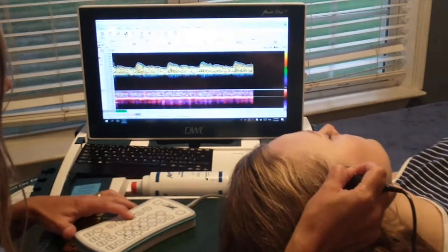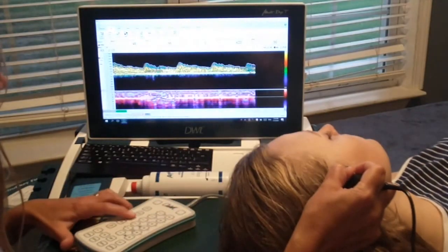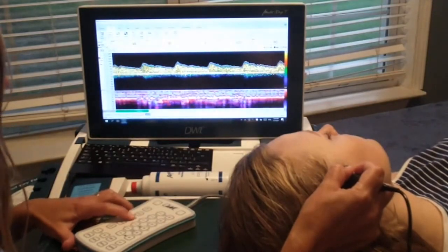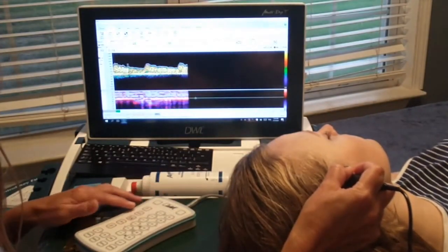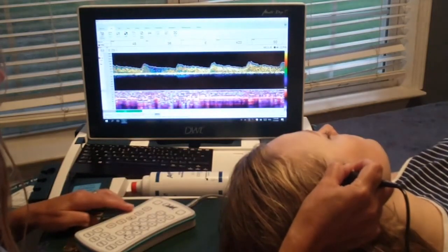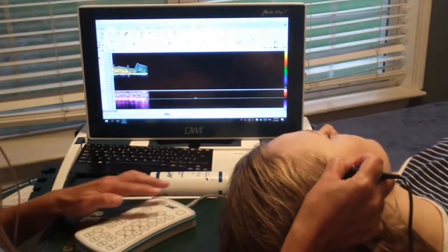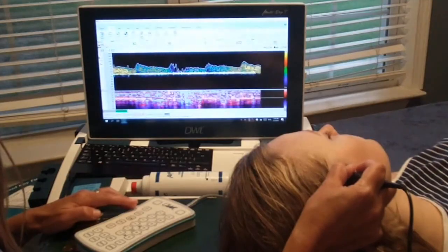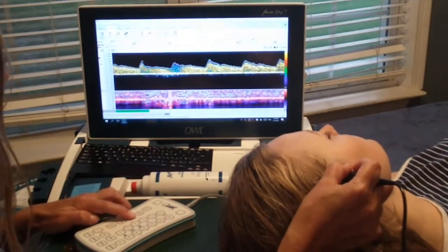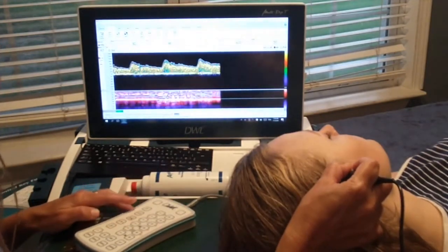44. Save. 46. Save. 48. Save. 50. Save. 52.